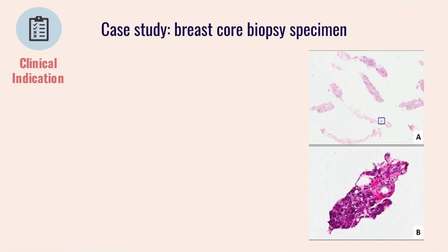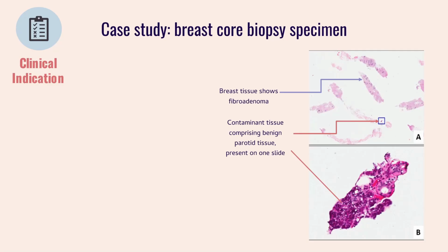Knowing the clinical indication and impression and what should or should not be present is important. This case study illustrates the point. The case was a breast core biopsy specimen showing a fibroadenoma and containing a fragment of benign parotid gland tissue on a single slide, seen on higher power in picture B. Given that the contaminant was seen only on one slide, it is easy to assume that the contaminant originated at the water bath stage, and one might make the mistake of not investigating this issue any further.